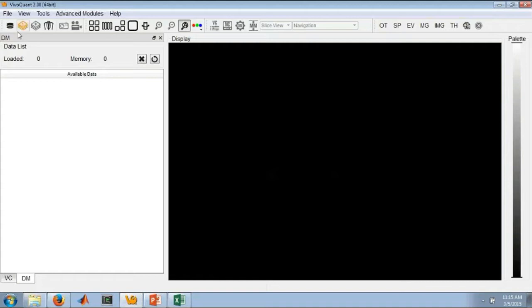We've really tried to streamline a lot of the UI design of the software to make it more efficient, easier to use, and easier for you to go from point A to point B with your data.